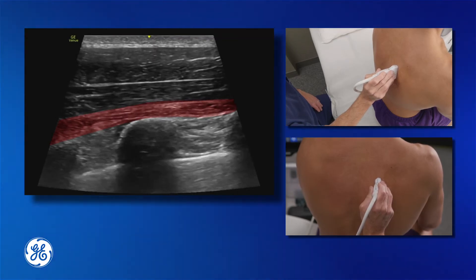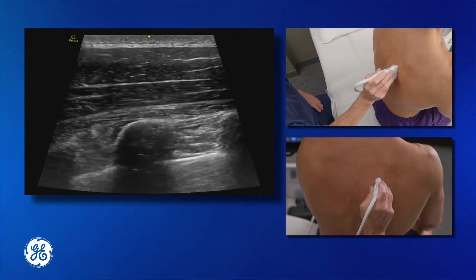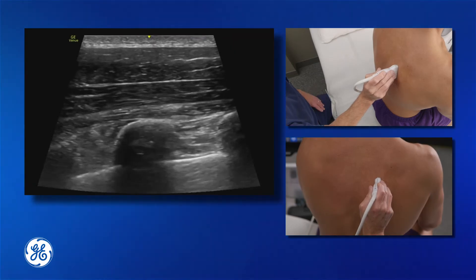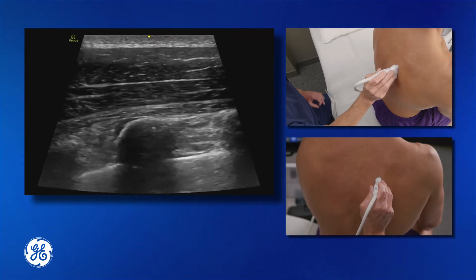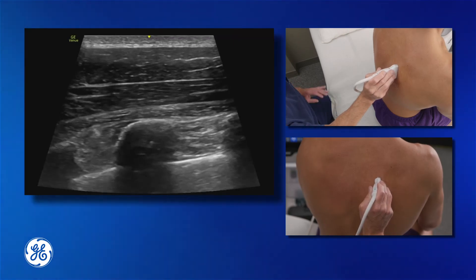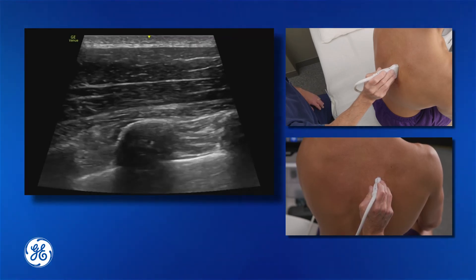We can see our muscles very clearly laid out here. I have my patient sitting, though this can also be done in the lateral position. If this block is being done for bilateral control, sitting is a slightly easier way to perform it. But if you're doing this procedure when the patient is already asleep, turning them laterally is going to be of benefit.